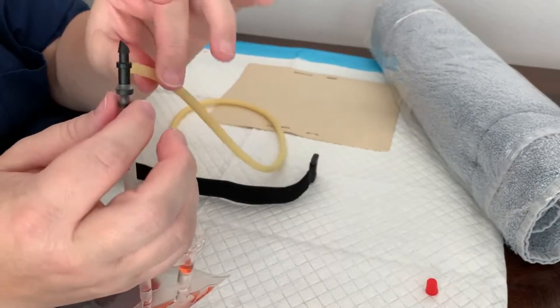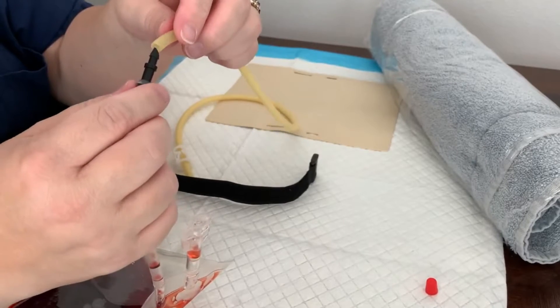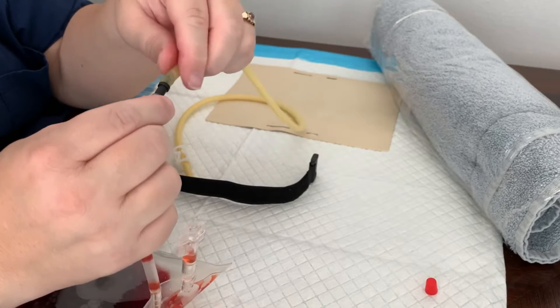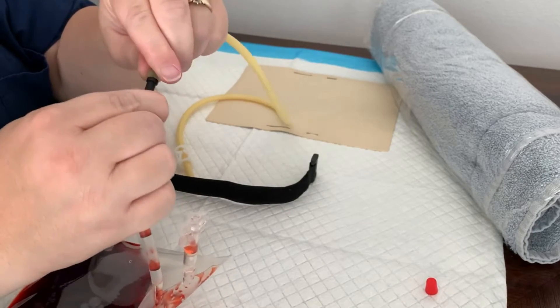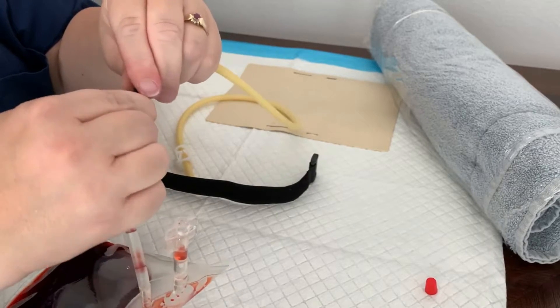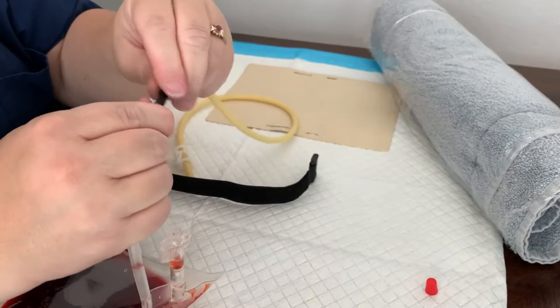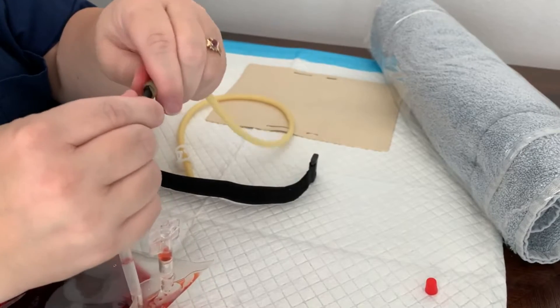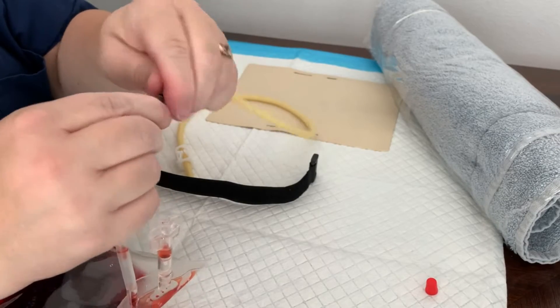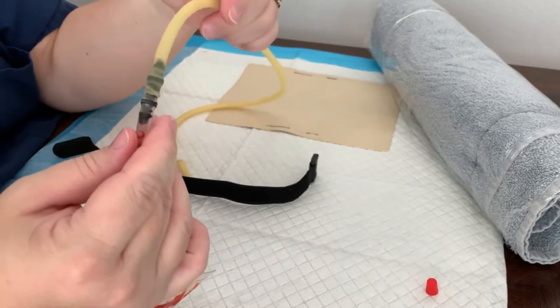You might want to wear gloves while you're messing with the fake blood because it can get you red. Then we want to attach our rubber tubing here — you want to try to get that over the second lump of the connector tube as well. Okay, our tubes are connected.